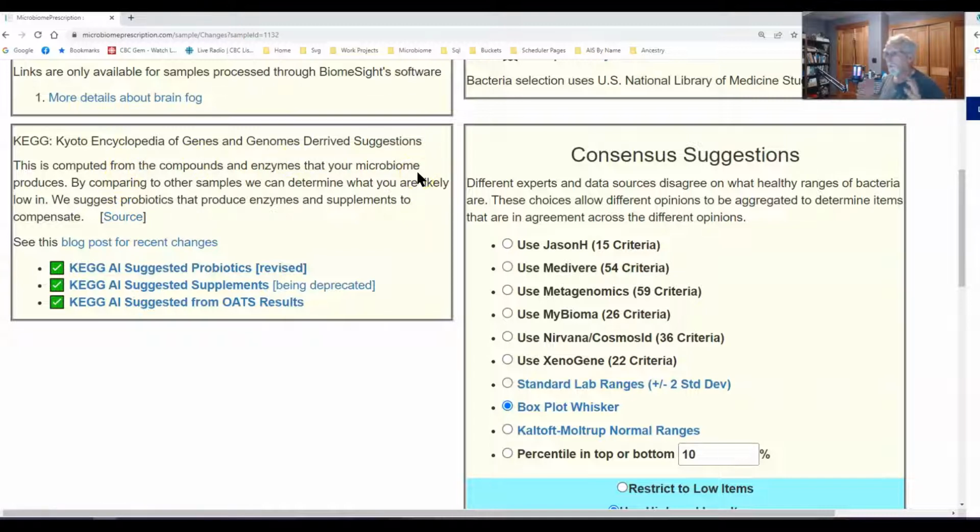And that one works strictly off species and strain. So if the lab doesn't list out literally hundreds of species, we can't use it. We cannot, the data just isn't there. If we get down to the species and genus level, species and strain level, we are able to make use of this data and other data.